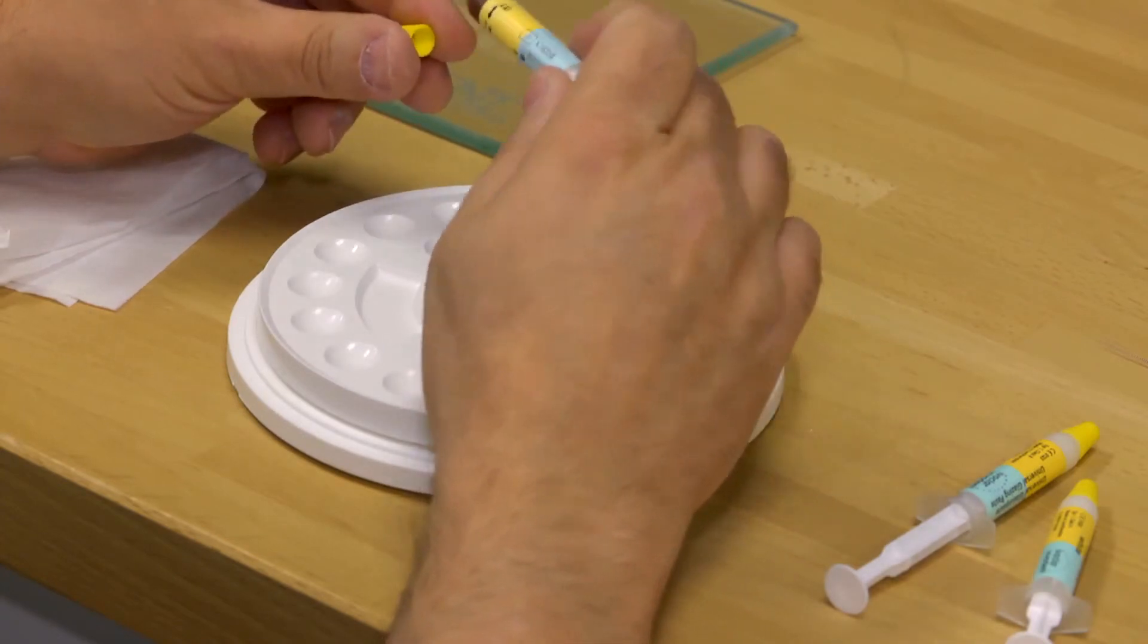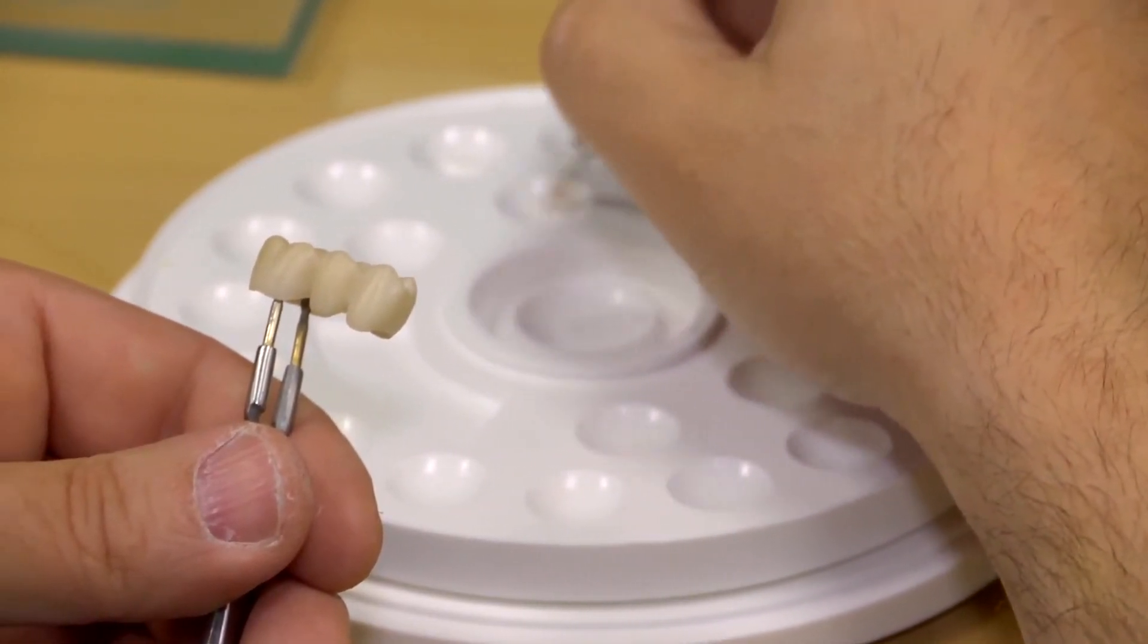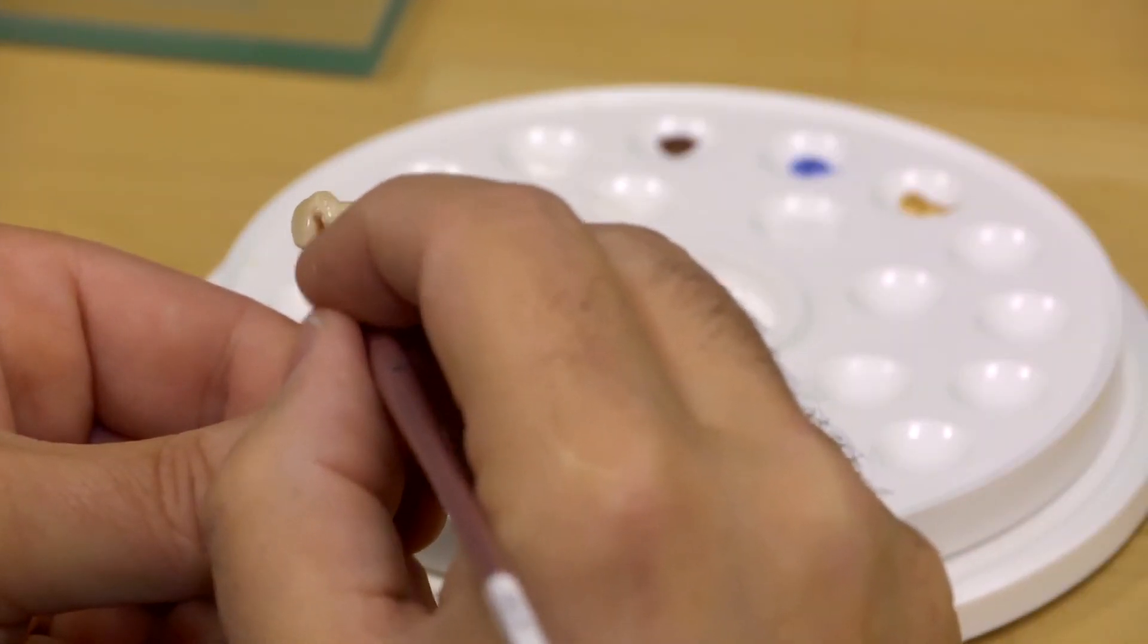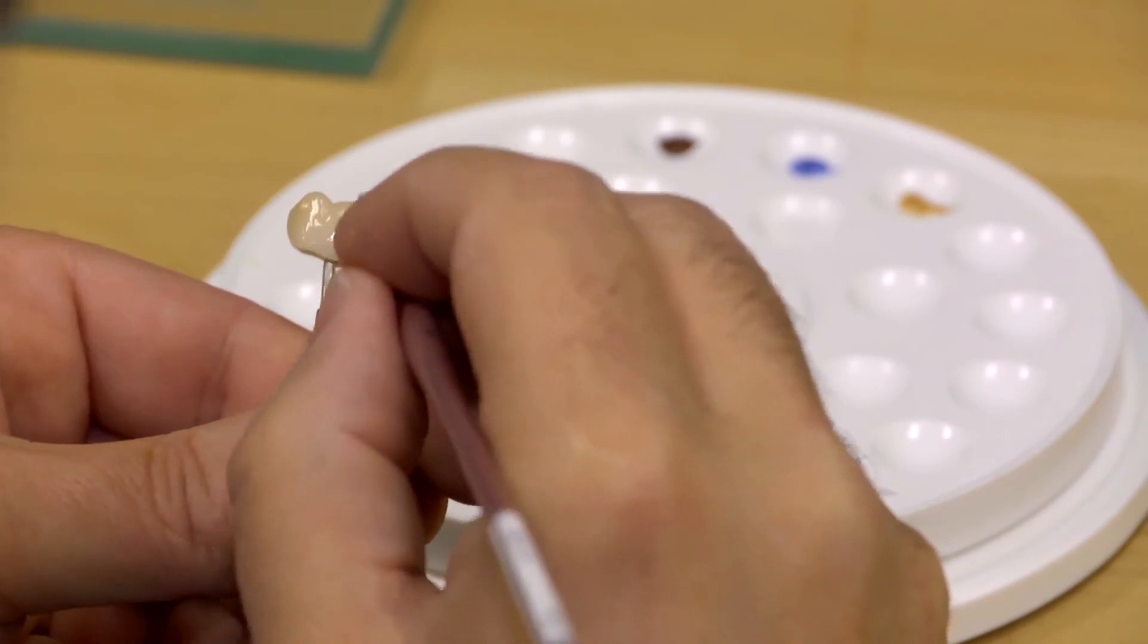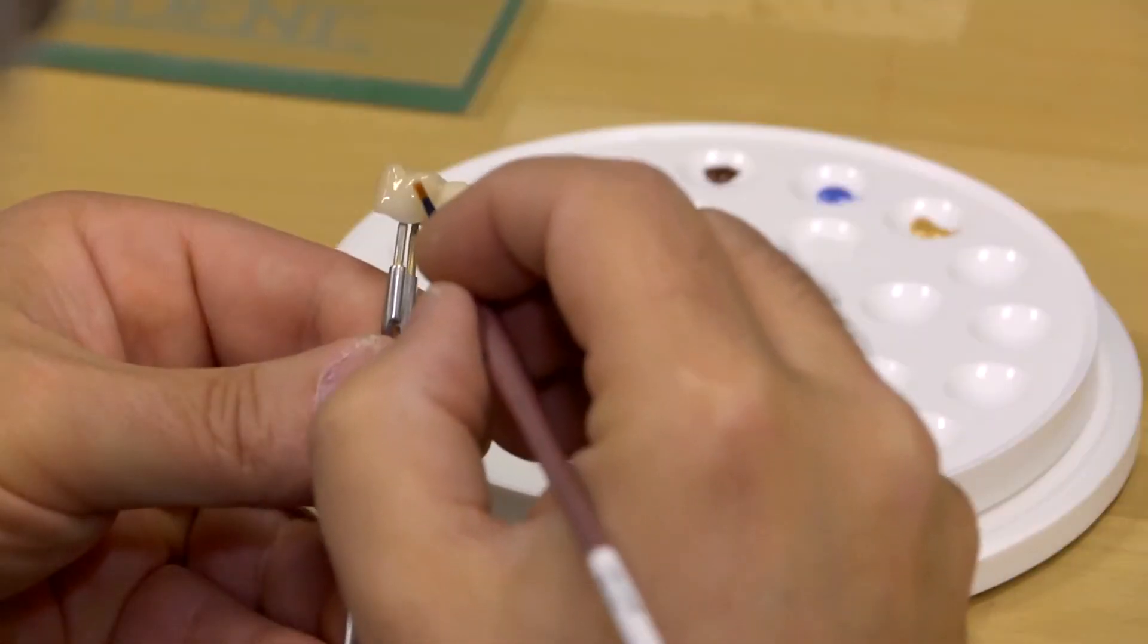However, due to the relative high opacity of the material, experience has shown us the need to shade the crown a bit darker than the listed prescription. Lighter shades sometimes only require a minor adjustment while darker shades may need to be stained a full shade darker to achieve the desired final shade.